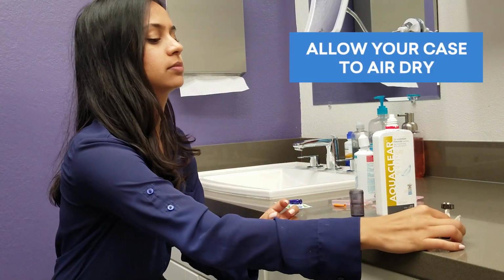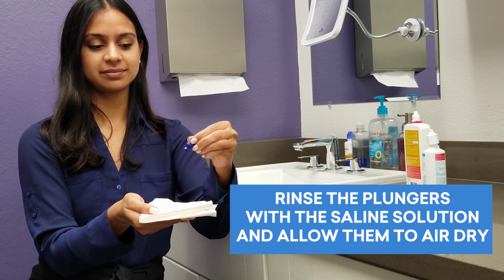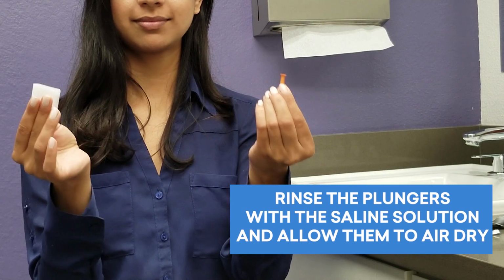Allow your case to air dry. Rinse the plungers with your multi-purpose saline and also allow them to air dry. Squeeze the insertion plunger several times to remove all moisture to prevent bacteria from growing inside.